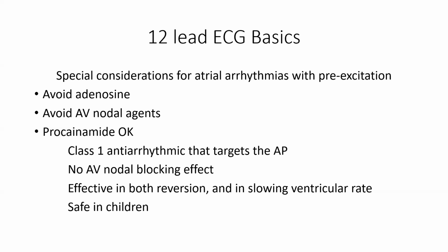If the patient is unstable, I would imagine then that you would follow ACLS protocol and perhaps cardiovert them out of it. But it may not always be possible for you to know that a patient has an accessory pathway. If it's known to the patient, obviously that's helpful information that hopefully they would be able to give you.